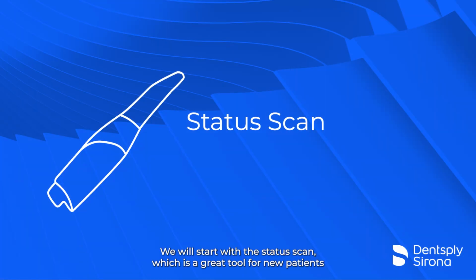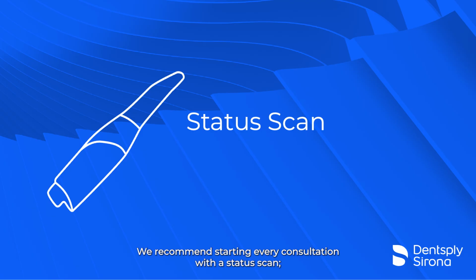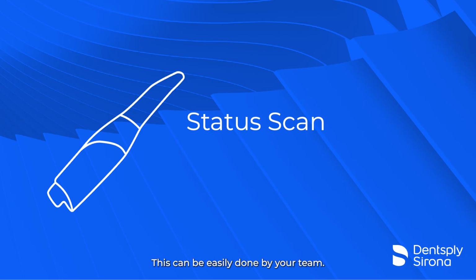We will start with the status scan, which is a great tool for new patients and checkup appointments. We recommend starting every consultation with a status scan. This can be easily done by your team. The status scan helps you to monitor the patient's oral health and have an overview of the situation. It's also very helpful with patient communication.